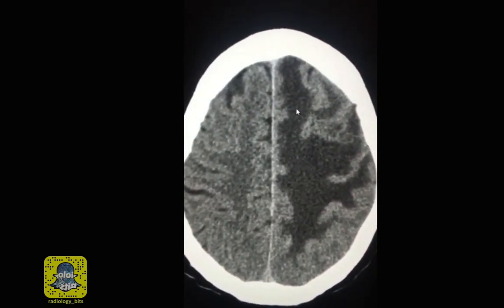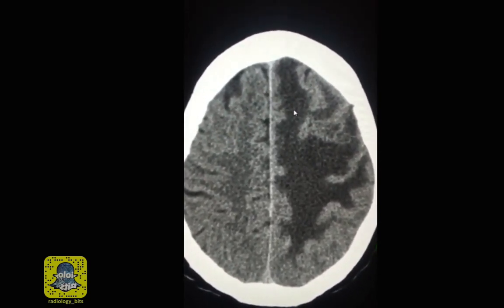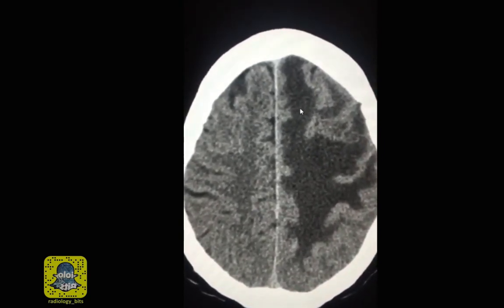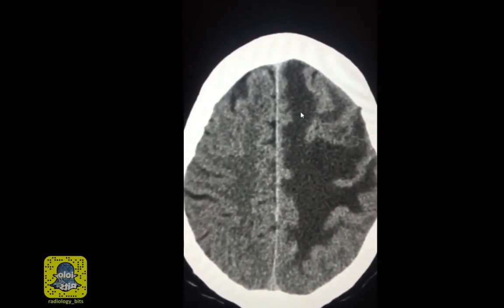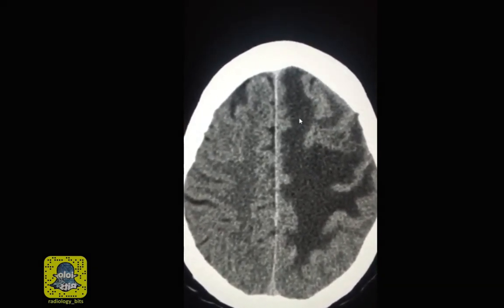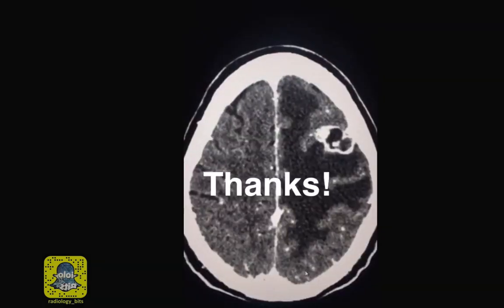A practical point, especially for junior residents, please differentiate between what's vasogenic and cytotoxic, since that's the main distinction on an on-call CT of the brain between what you're going to call a stroke versus other things.